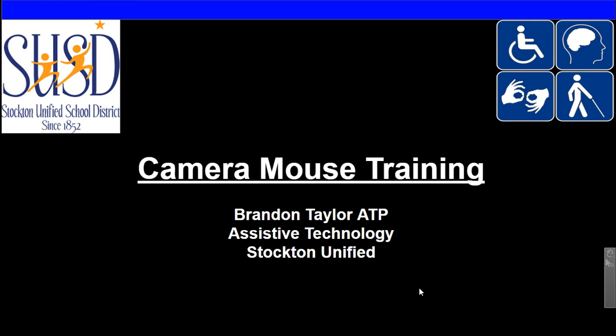Today we're going to go over a product called Camera Mouse. Camera Mouse is a way to use mouse emulation using head movements and dwell time using the internal web camera of your computer. I'm working on a Windows device here.